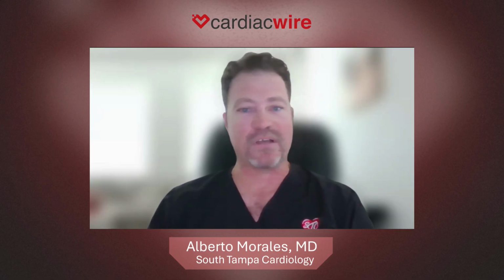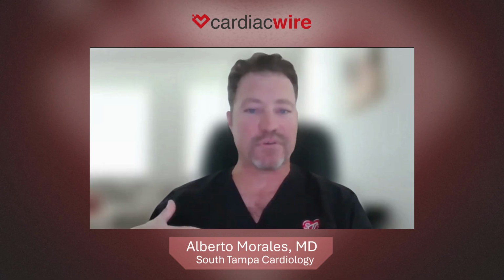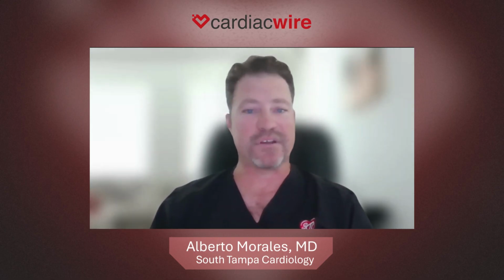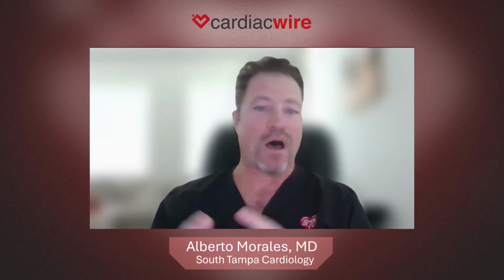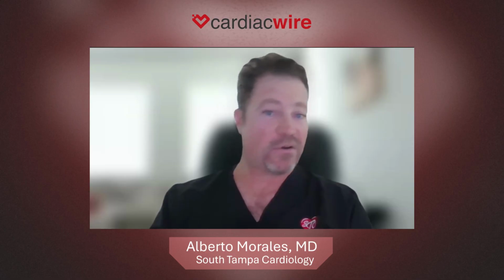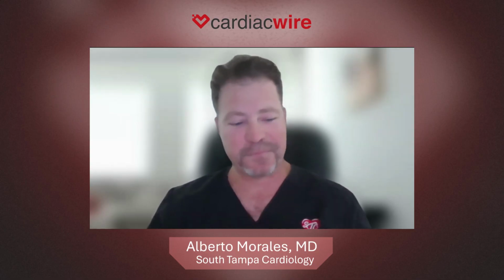As far as scanning outside, I know Arineta has the footprint and the FDA clearance for lung screening, and that is something that a lot of other offices take advantage of, where you can do a calcium score and a lung screen all in one. It would help with ROI and facilitating multiple patients. We don't take advantage of that. We don't do the lung screening. I don't have a radiologist. I read everything, so I mainly focus on cardiovascular.